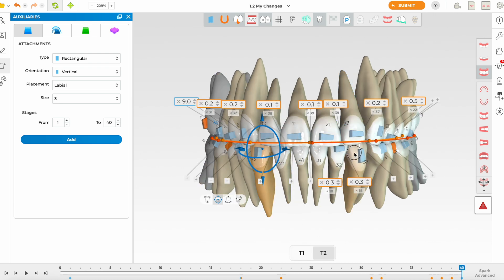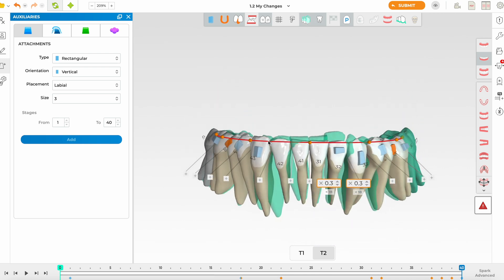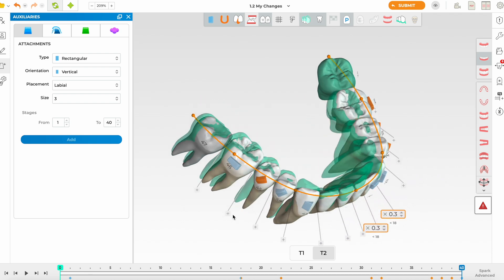The deep bite correction will come mainly from intrusion of the lower incisors. Taking them as a group, the intrusion is mild to moderate — not excessive, so I think it's achievable. I'm also going to slightly extrude the lower molars and premolars, as that will help with deep bite correction.